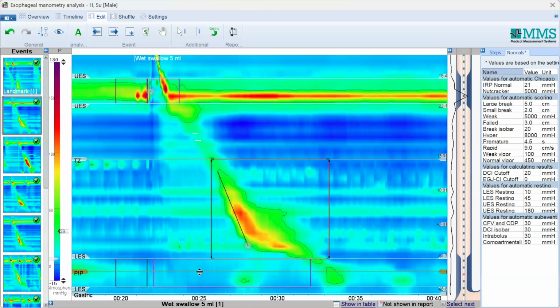The normal esophagus will be like a cylinder, but because there is always pressure inside the esophagus, the esophagus will start to dilate. This is what they call the bird beak.